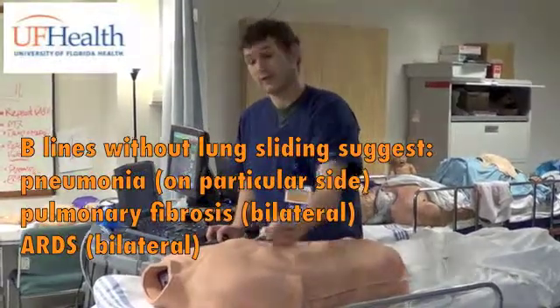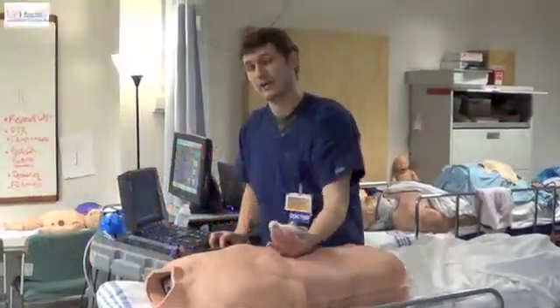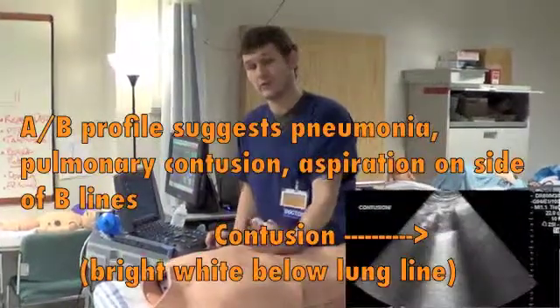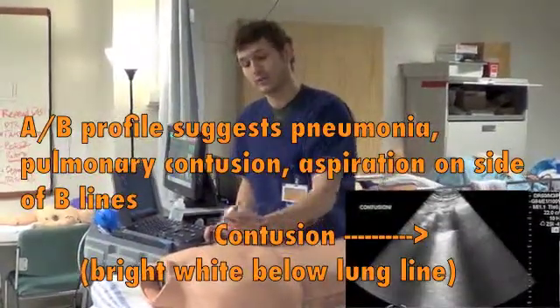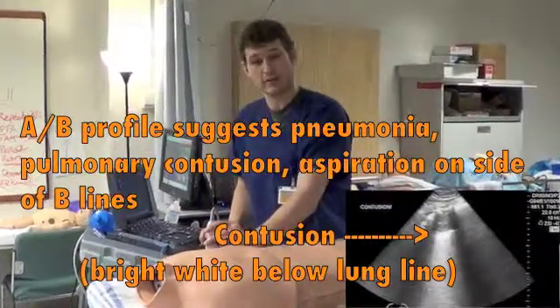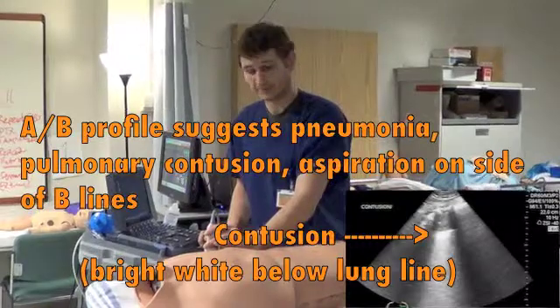If you have a mixed profile — with an A profile on one side and a B profile on the other — on the side of the B profile you would be concerned for pneumonia or pulmonary contusion as part of your assessment.